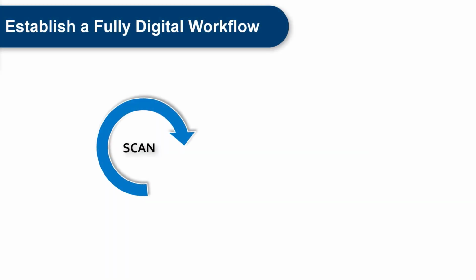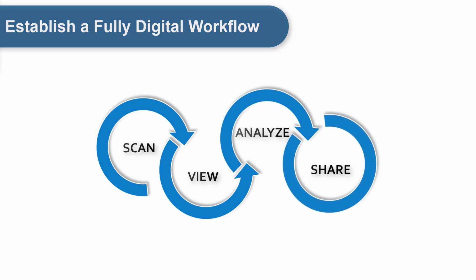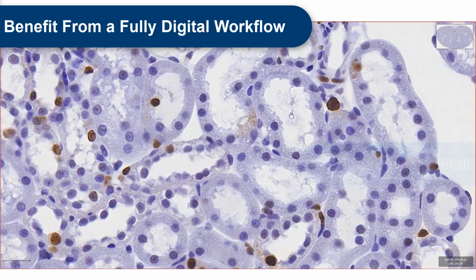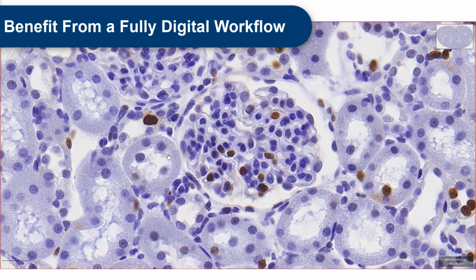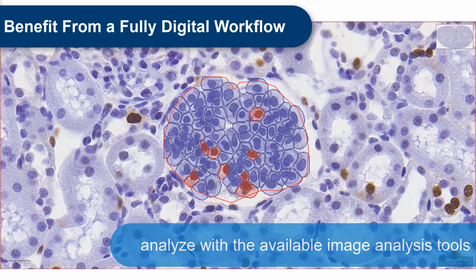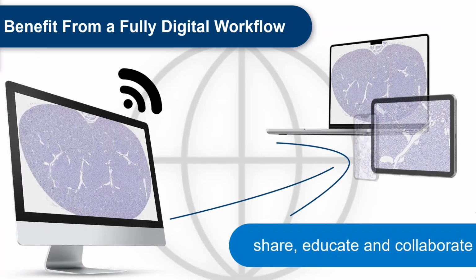Just like that, you can easily establish a fully digital workflow. Take advantage of all the benefits of whole slide image creation. Whether it is for simplified documentation, high-quality publications, reliable image analysis, vivid teaching, or productive collaboration with colleagues, with mvSlide, the power of digital microscopy is at your fingertips.